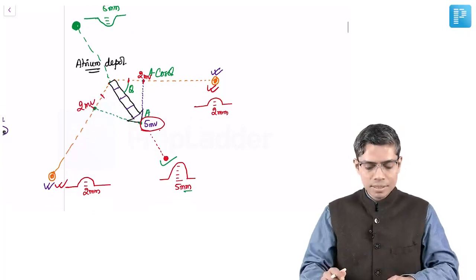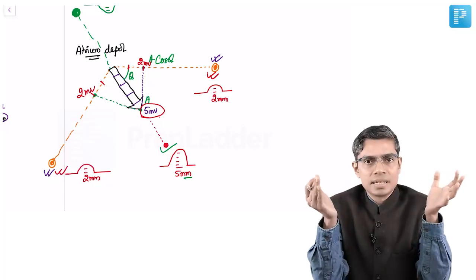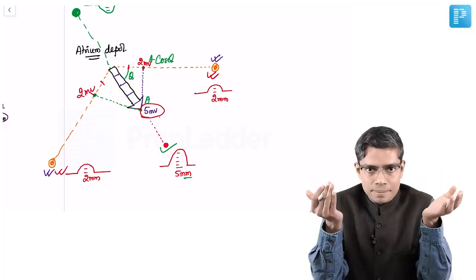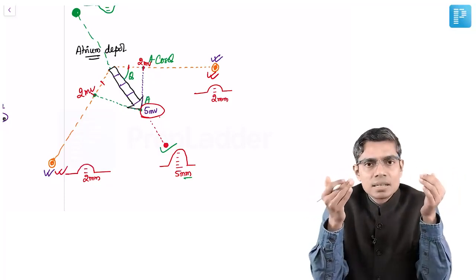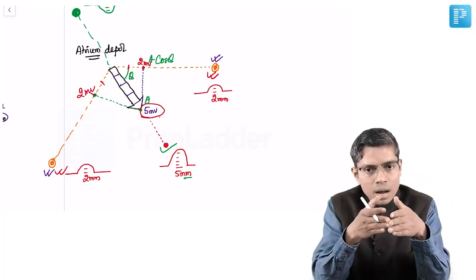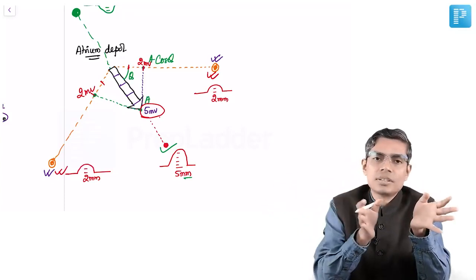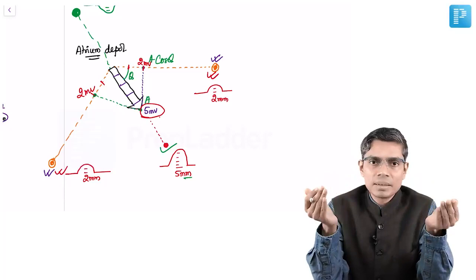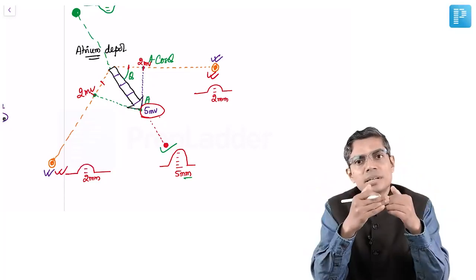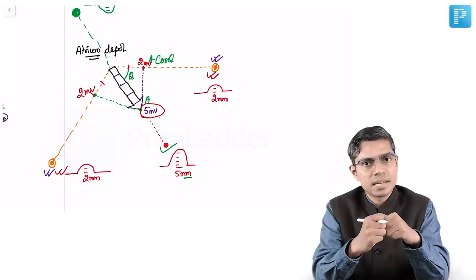So this way the voltage vector will be recorded by different leads in different manner. And how can I understand how the voltage vector will be recorded by a different lead? You have to do the vectorial analysis either by mathematics or by dropping a perpendicular from the mean vector on the axis of that lead. Getting my point?